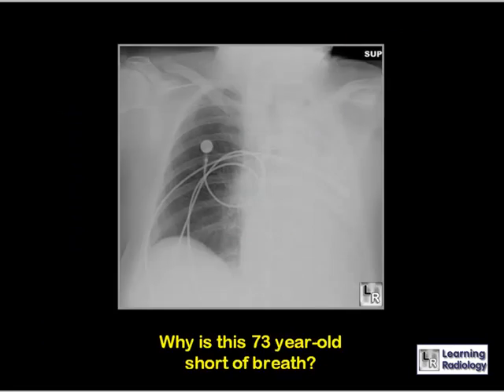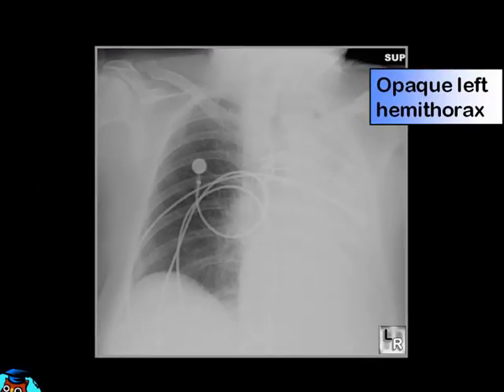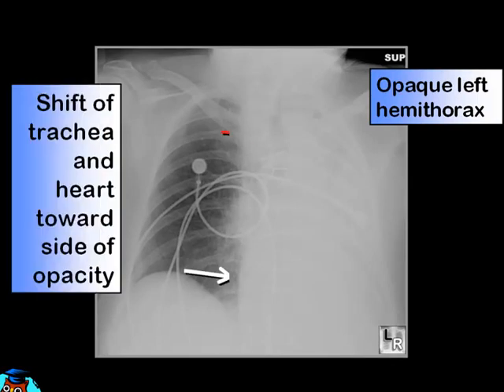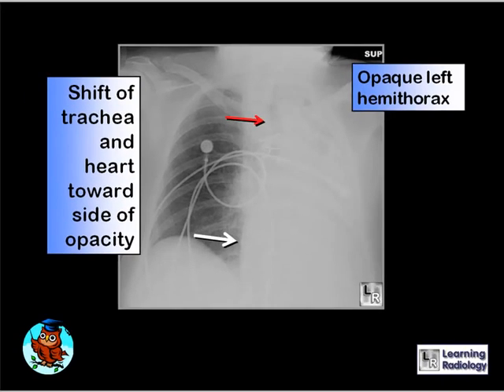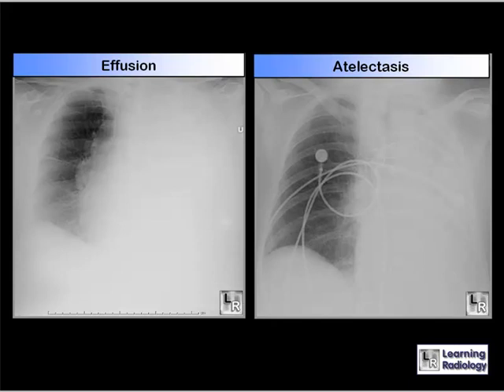Why is this 73-year-old short of breath? Again there is an opacified left hemithorax, but here the trachea and heart shift toward the side of opacification, indicating volume loss — characteristic of atelectasis of the entire left lung. This patient also had an obstructing bronchogenic carcinoma. Note the differences: effusion shifts structures away, atelectasis shifts toward. With underlying malignancy there may be a balance between pleural fluid and atelectasis, so even with an opacified hemithorax there may be no shift of mediastinal structures.